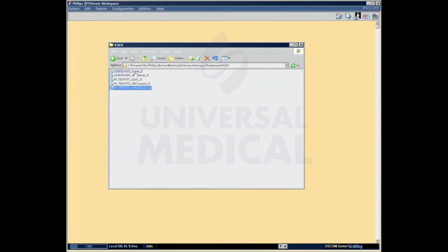4.5 megabyte per. So the more report information that was generated, the more of these files are created, the more space your hard drives used, the less space you're going to have for acquiring patients or for processing patients. So a good thing to do, if you think that you are getting exceedingly full on your database size, again, database size referring to hard drive utilization, this is definitely one place to go look. There can be many places, but this is a very, very common one.